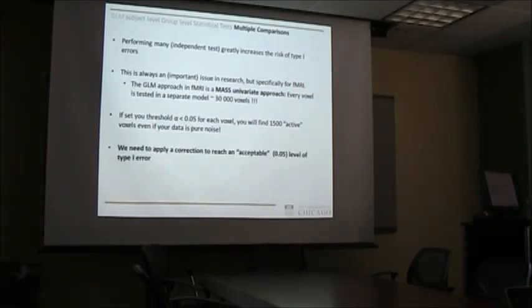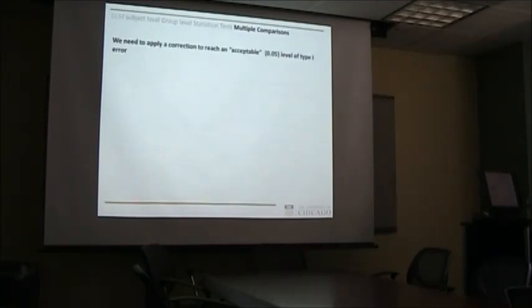So you need to do something to correct for that. Basically, you want to correct your p-values to incorporate this large number of tests that you're running. And you can split this issue of how you would do that in two parts. First is which method would you use, and I want to talk a little bit about that. You could do a Bonferroni test, a family-wise error correction, false discovery rate. I'm going to talk about it in the next slide.